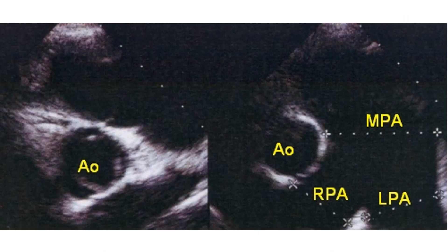Dilated main pulmonary artery, left pulmonary artery, and right pulmonary artery are seen on the short axis view of the 2D echocardiogram. Usually the aorta and main pulmonary artery are of comparable size; however, here the main pulmonary artery is grossly dilated and approximately twice the size of the aorta, due to severe pulmonary hypertension.